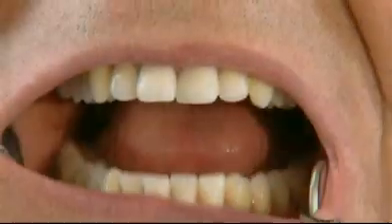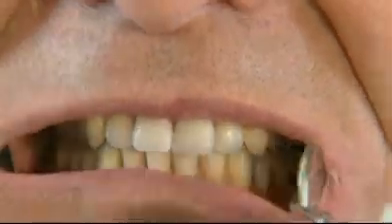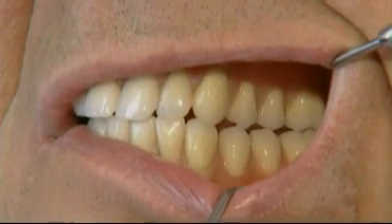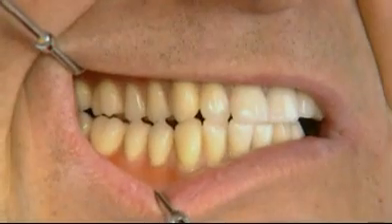The completed dentures are incorporated. The final check of the bilateral balanced group guidance, the aesthetic appearance, statics, functions, and phonetics shows that the dentures are fully functional. This prosthetic solution helps patients to regain an important part of their quality of life.